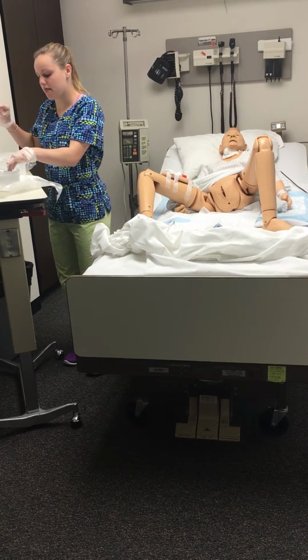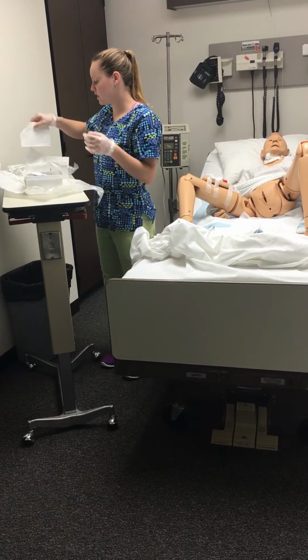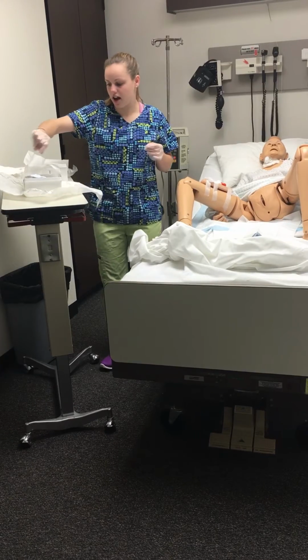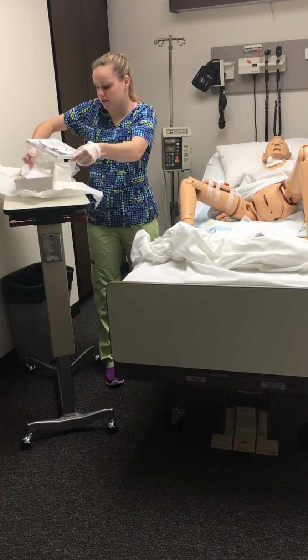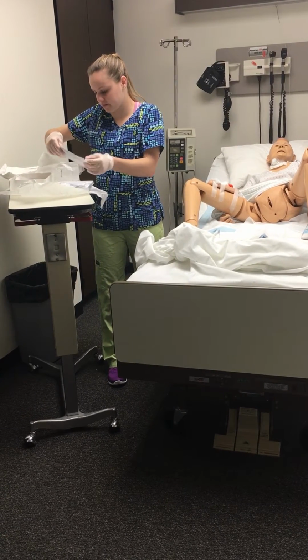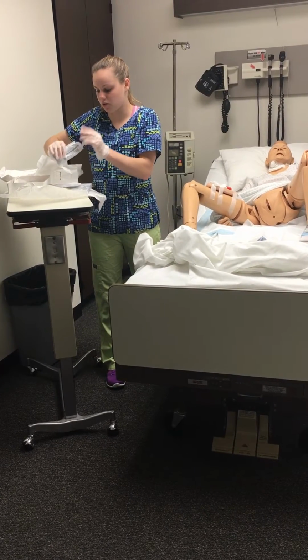Okay, and then this we don't need, but some facilities like us to use it. And now I will put these two pieces apart, and I can open my swabs right here. I have two sets of swabs.